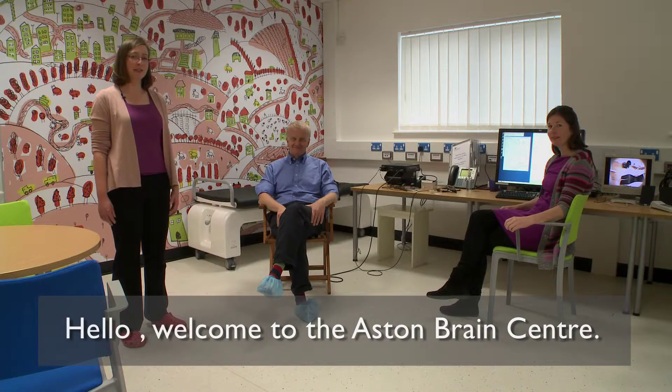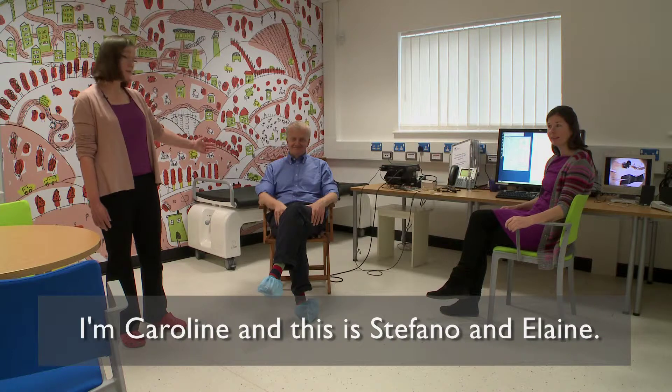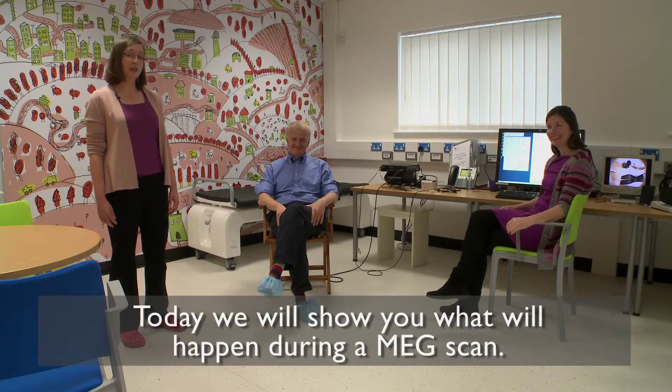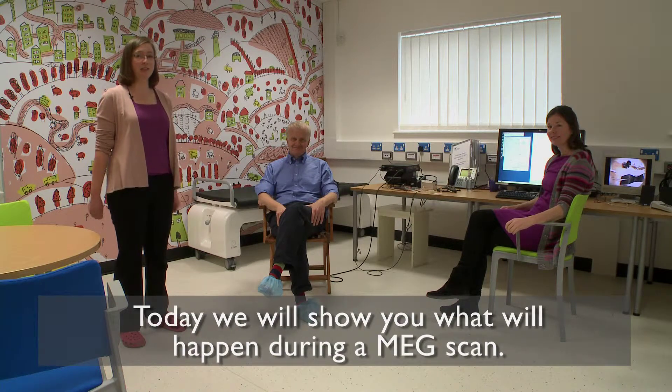Hello, welcome to the Aston Brain Centre. My name is Caroline, this is Stefano who's the consultant, and this is Elaine. Today we're going to take you through all the steps that will happen when you come for your MEG scan.